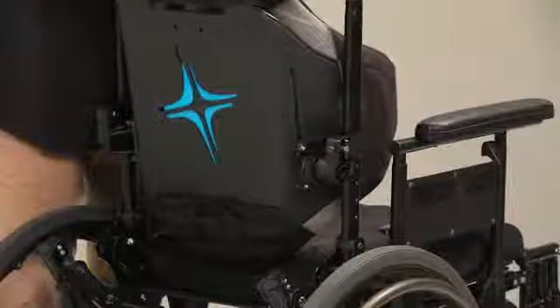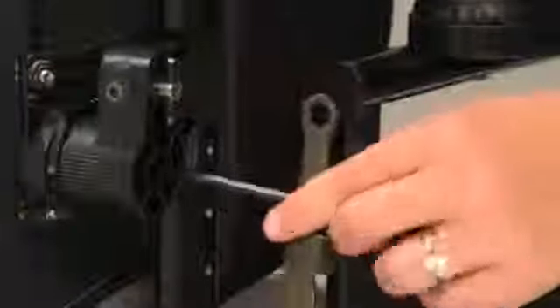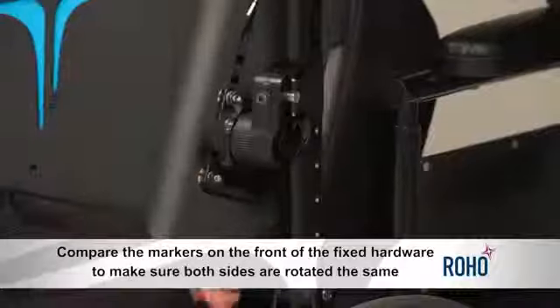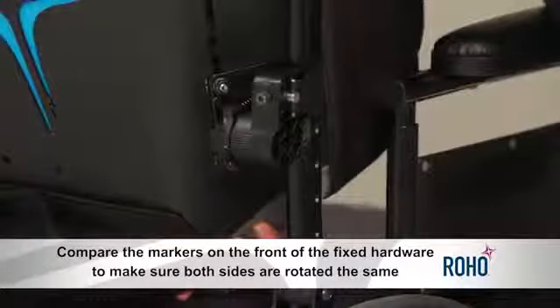Now you can slide the back shell forward or backward. Make sure the depth and angle positions on the left and right sides are equal by comparing the markers on the top of the triangle brackets. To adjust the angle, loosen the adjustment bolt approximately 2 full rotations. Now you can pivot the back shell back and forth. Compare the markers on the front of the fixed hardware to make sure both sides are rotated the same.